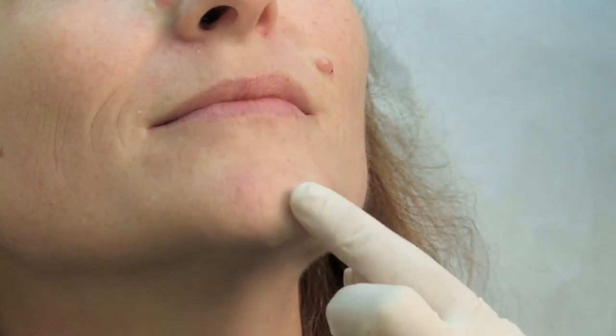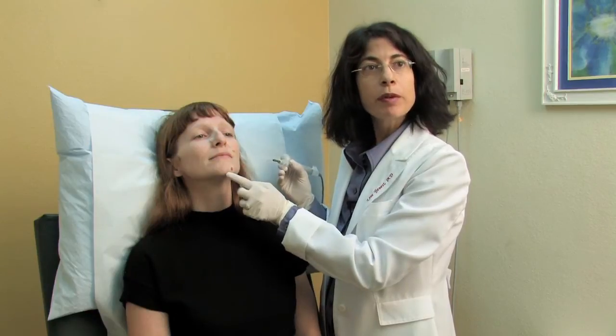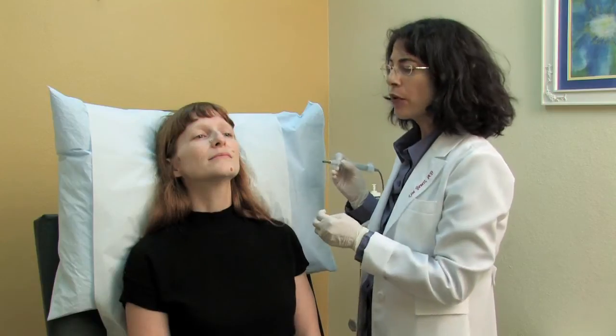Now you'll notice that the mole looks a little bit darker, and that's from the solution we used to stop the bleeding as well as the cautery. This will resolve in about a week after it goes through its healing process.